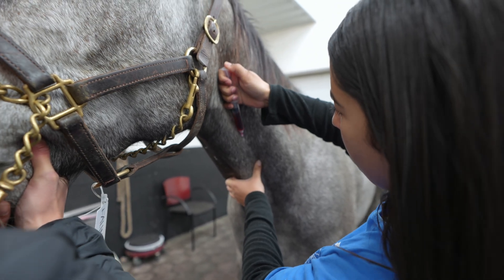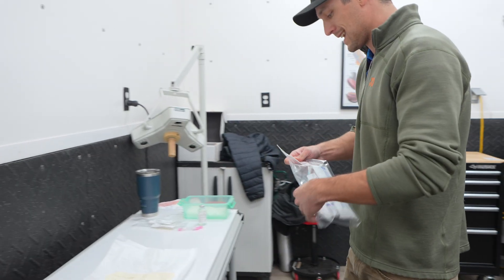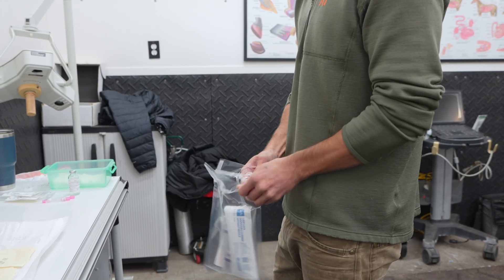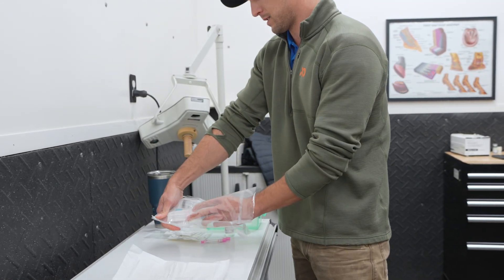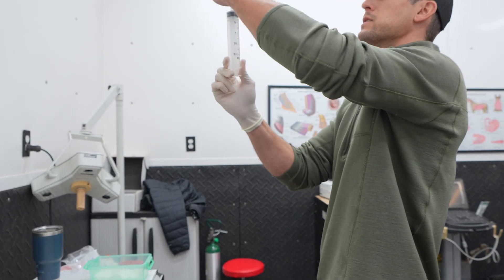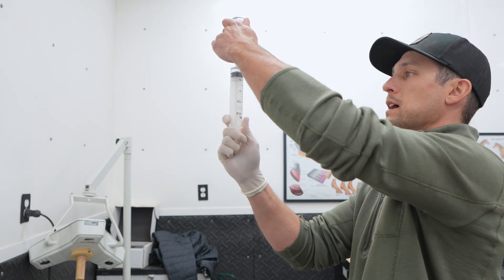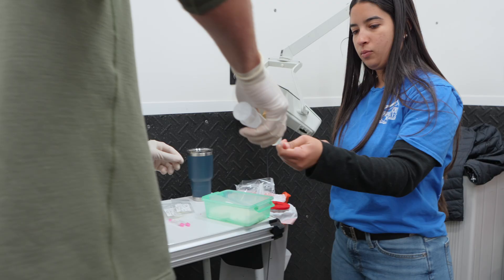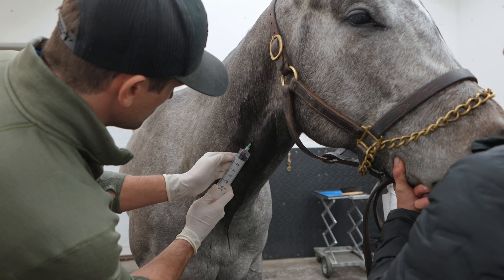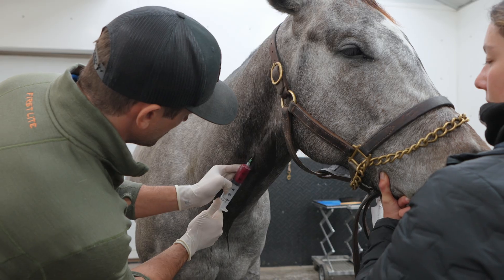She has a sterile scrub over her jugular vein, which is where we're going to draw the blood from to process the PRP. Everything inside this kit is also sterile — each one of these individually packaged items is handled sterile all the way from drawing the blood to isolating the platelets, so we won't get any blood clots in there. We'll put 60 cc's for this particular kit.